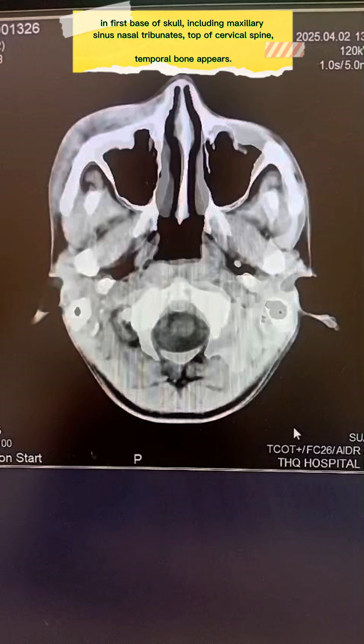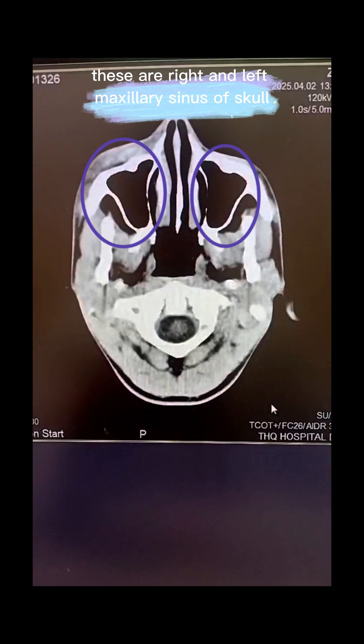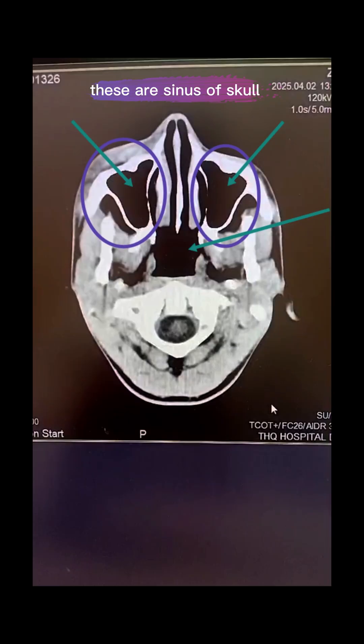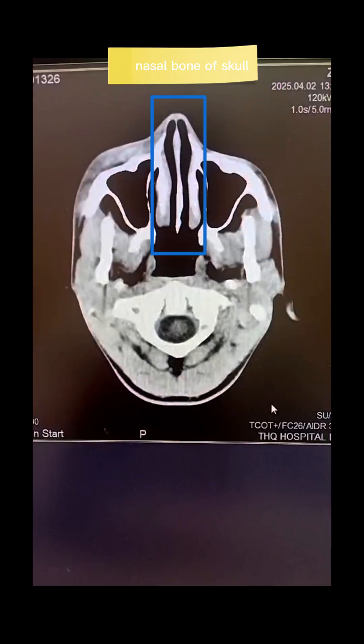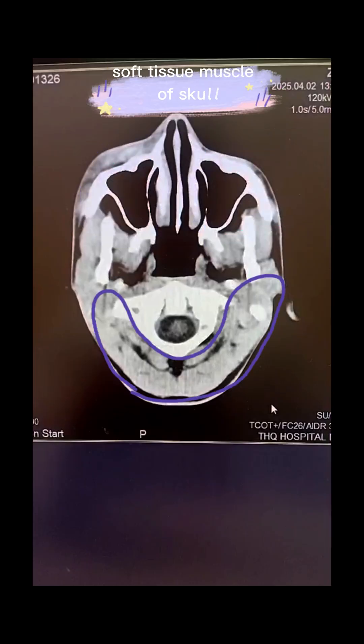In the first slice at the base of skull, structures including the maxillary sinus, nasal turbinates, top of cervical spine, and temporal bone appear. These are the right and left maxillary sinuses of the skull, along with the nasal bone, soft tissue, and muscle of the skull.